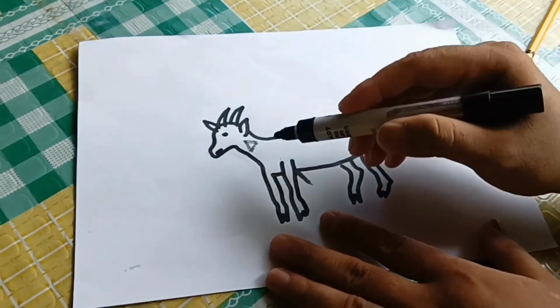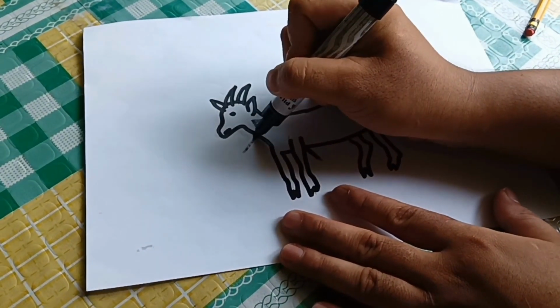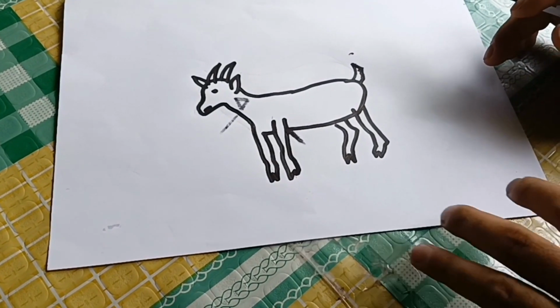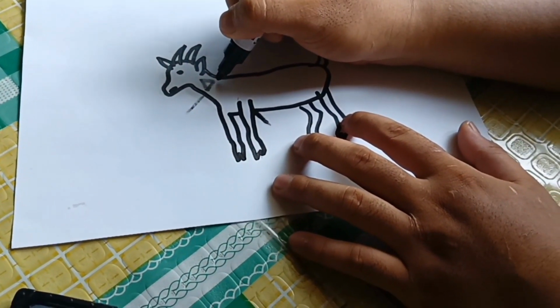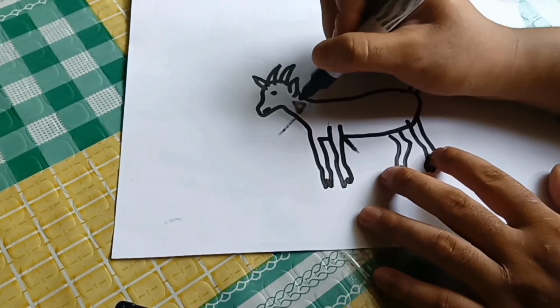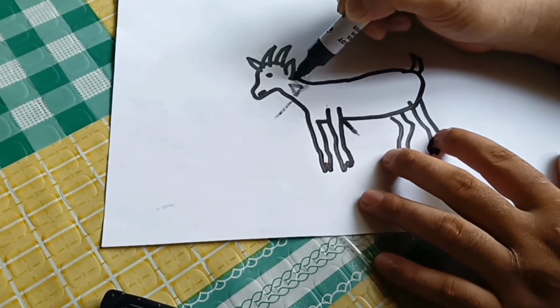For the intravenous injection, the site is at its jugular. The jugular veins is the perfect site for the intravenous injection. And for the intradermal injection, the site will be at the neck also. Injecting intradermal is only the skin of the goat. So this part will be the neck. This part will be the injection site for the intradermal injection.